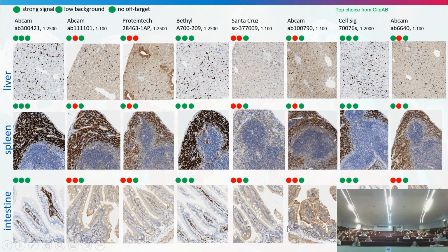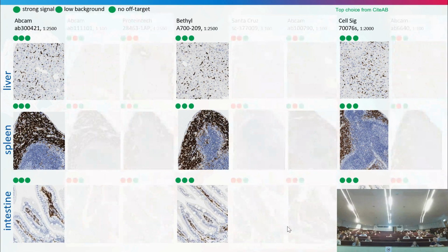And you could basically analyze all the antibodies. But the good news is there are some antibodies which are consistently well performing, and this is the strong antibody. So 3 companies here came up very nicely, all with identical pattern, all strong performers and the right signal, like in lamina propria, for example, in the intestine.